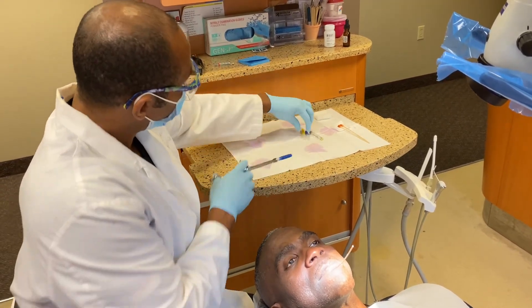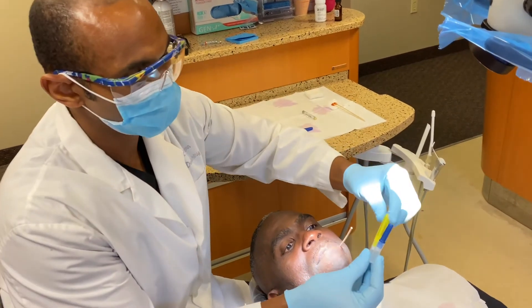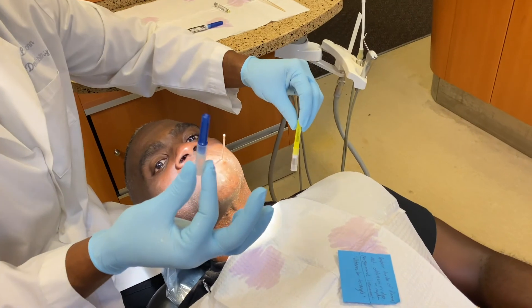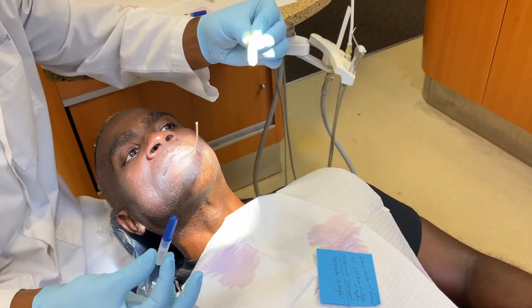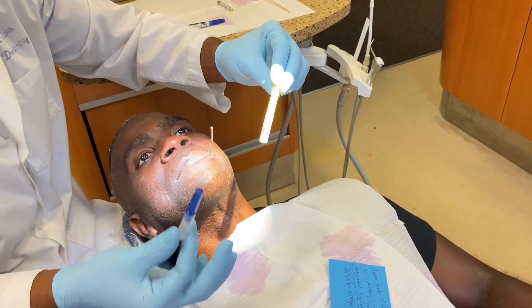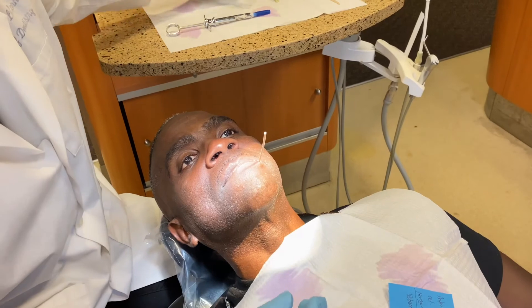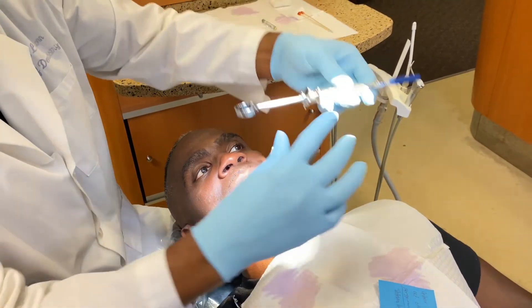We have two different types of needles: a 30 gauge short and a 27 gauge long. I use a 30 gauge short for every single injection that I give, but either one will work fine — use whichever one you have available.